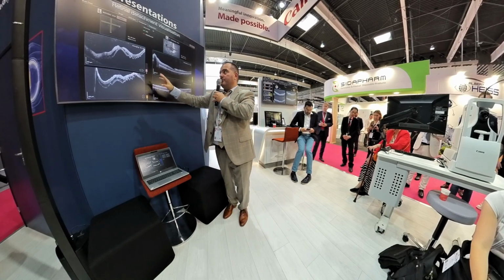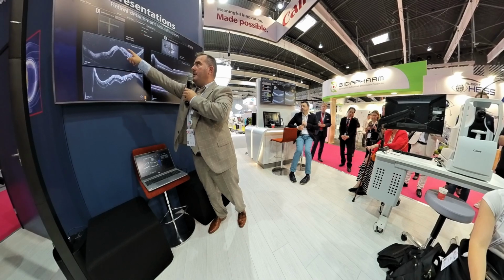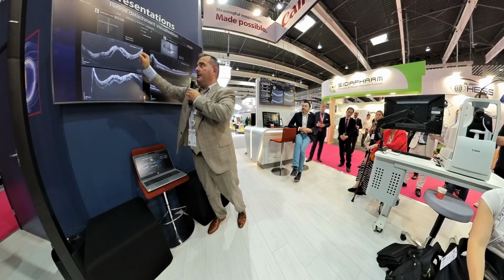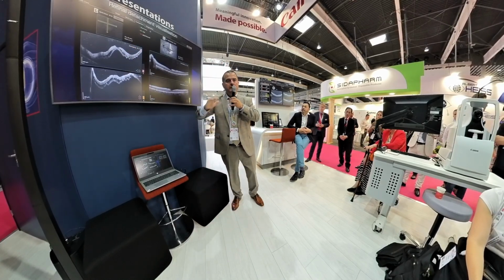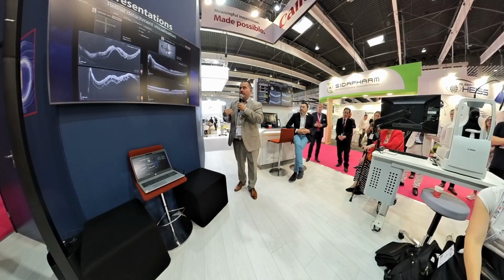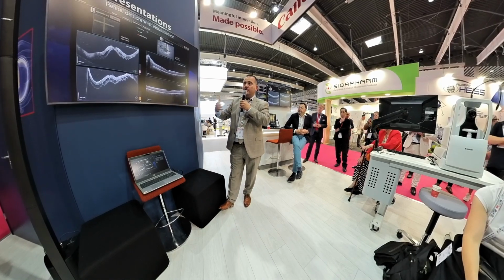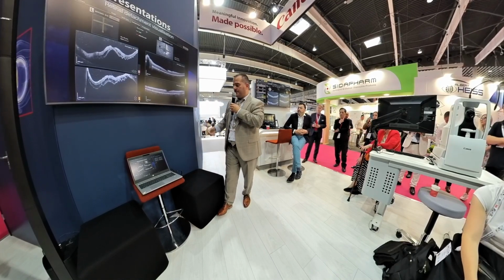So here I want to draw your attention: where is the pigment epithelium? Where is the macula? And where is the vitreous body? So the window of acquisition is really large, which is useful for everyday practice. We get more useful images.